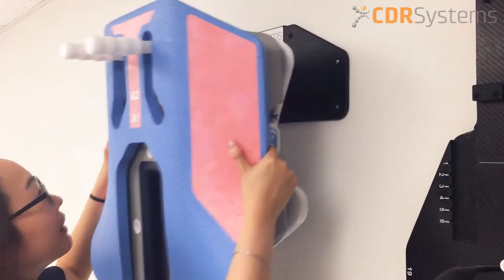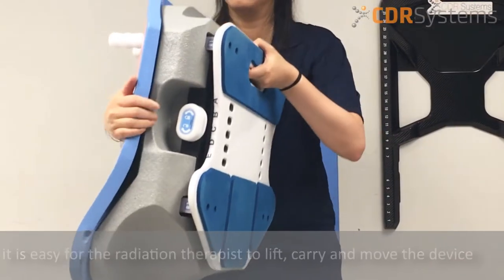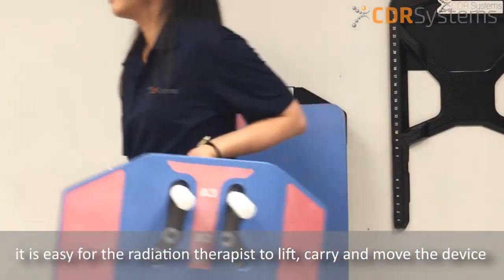Because of its light weight and the handles at the back of the bases, it is easy for the radiation therapist to lift, carry, and move the device.